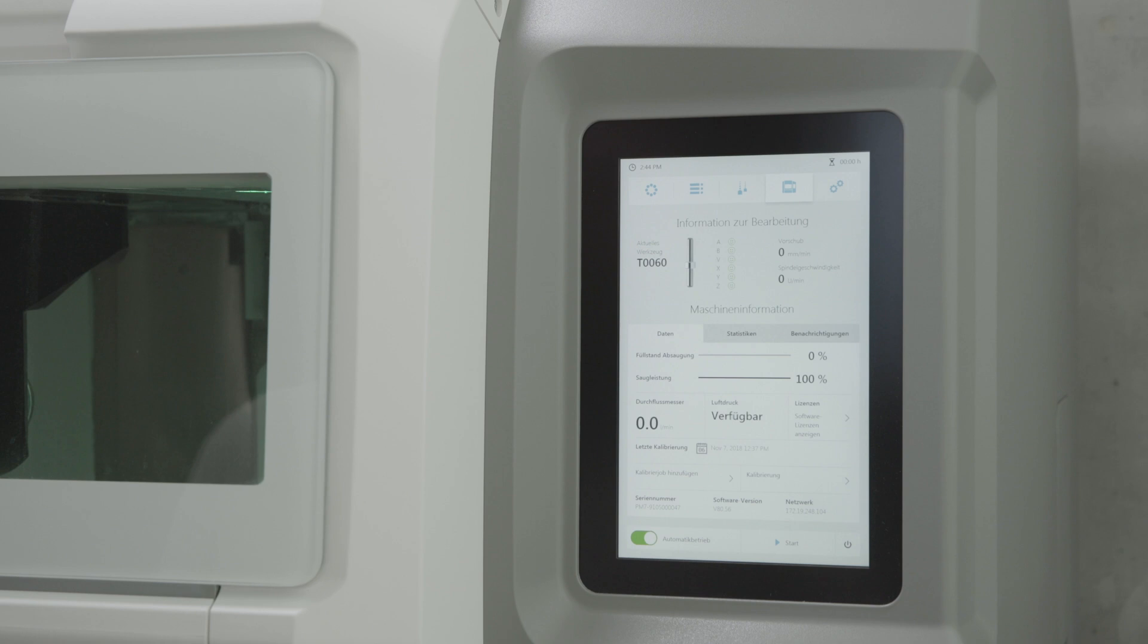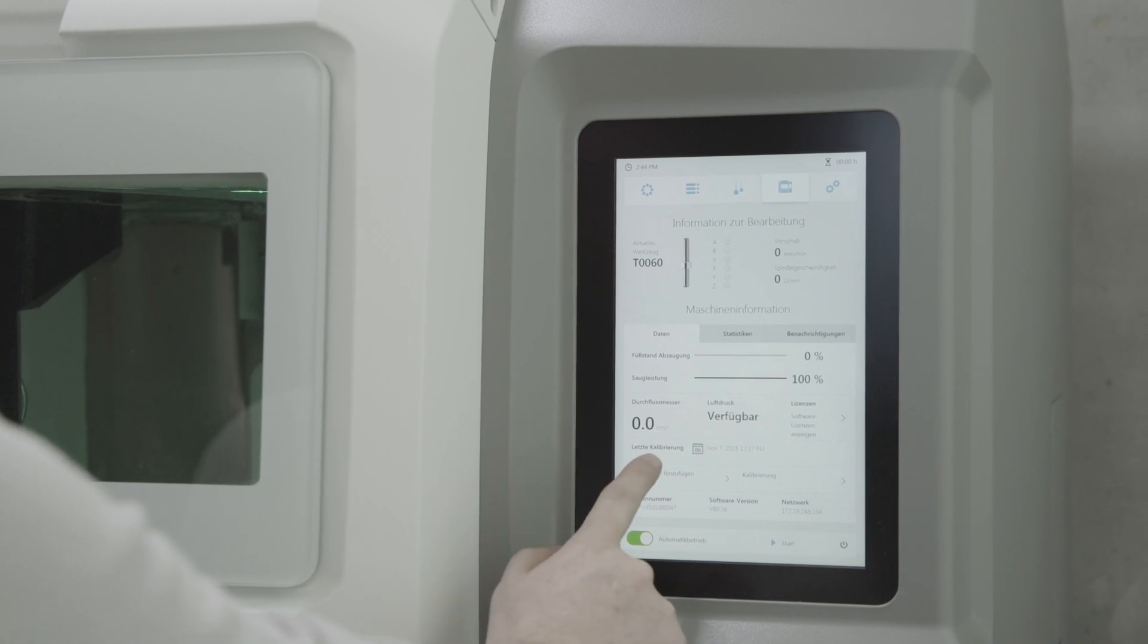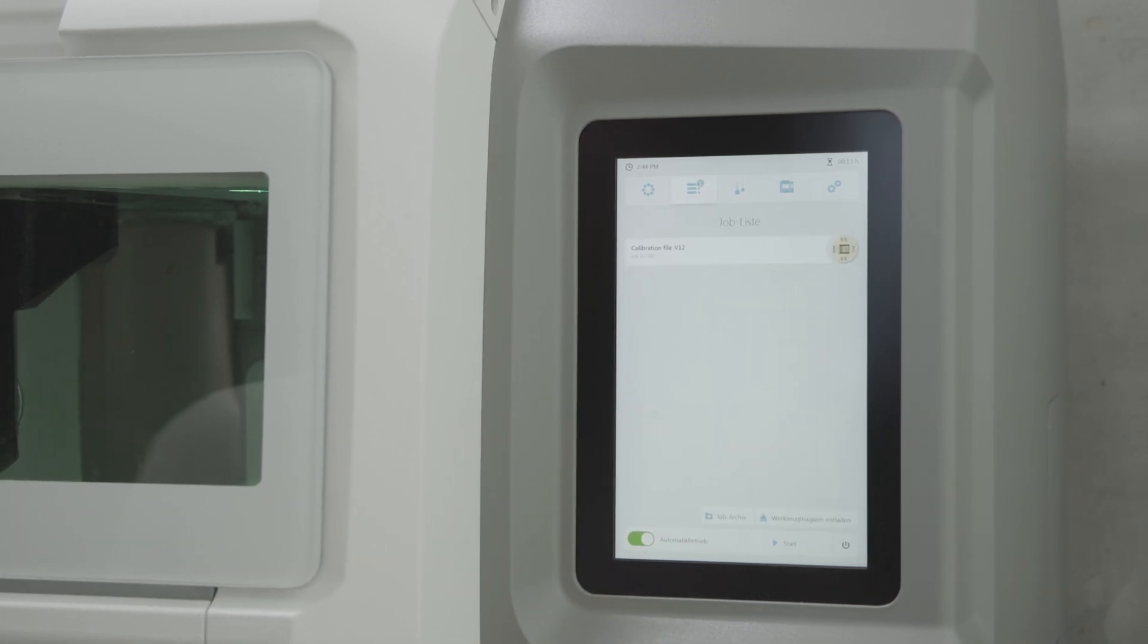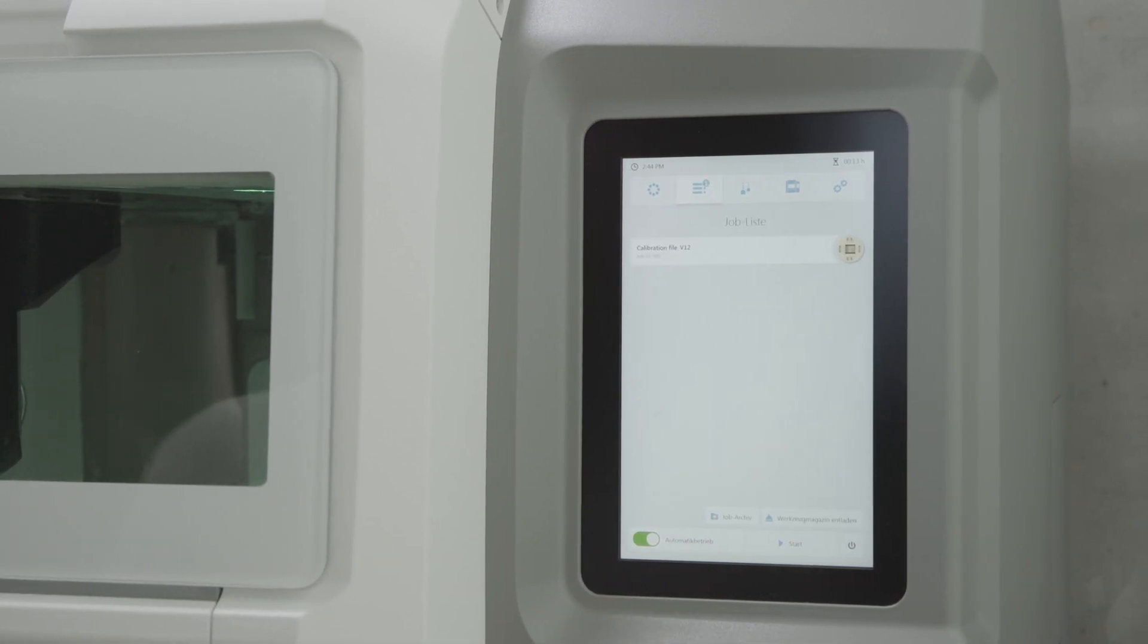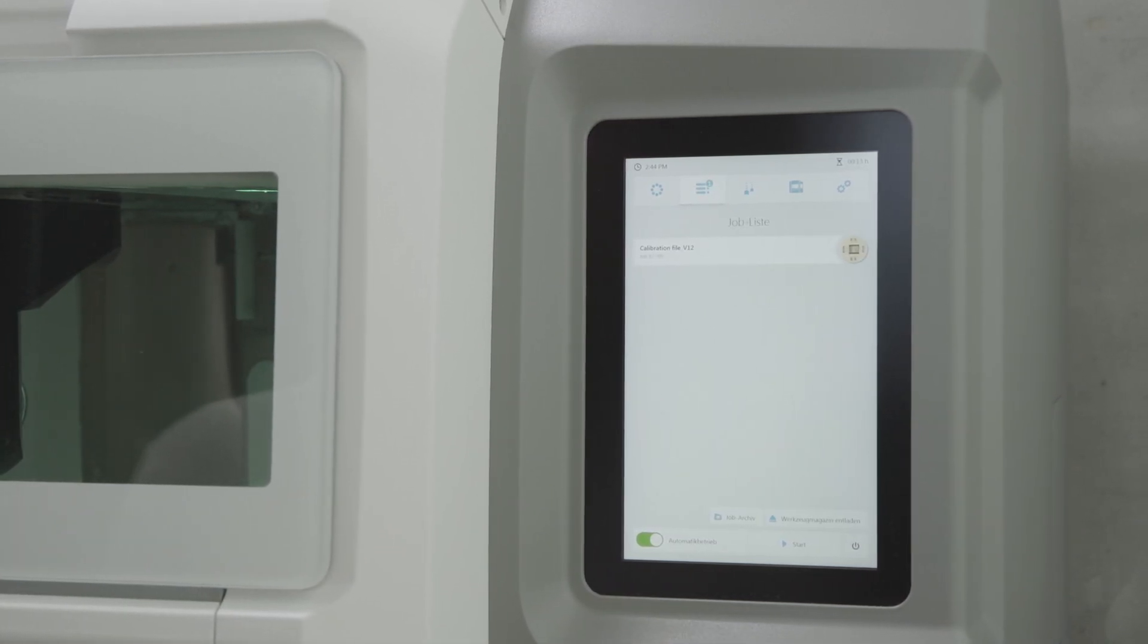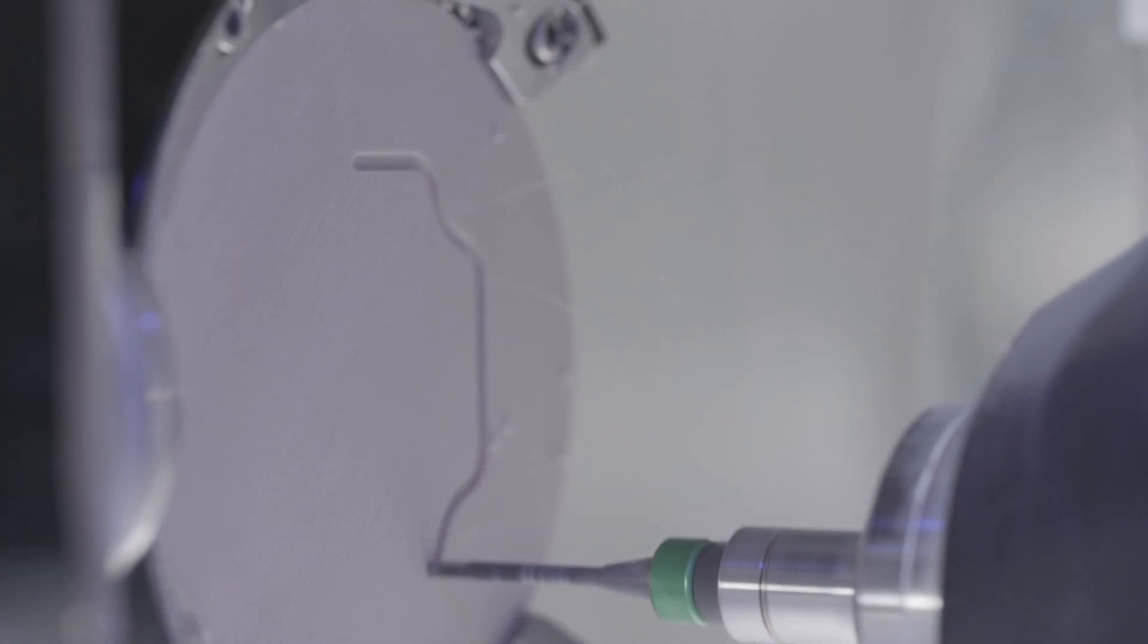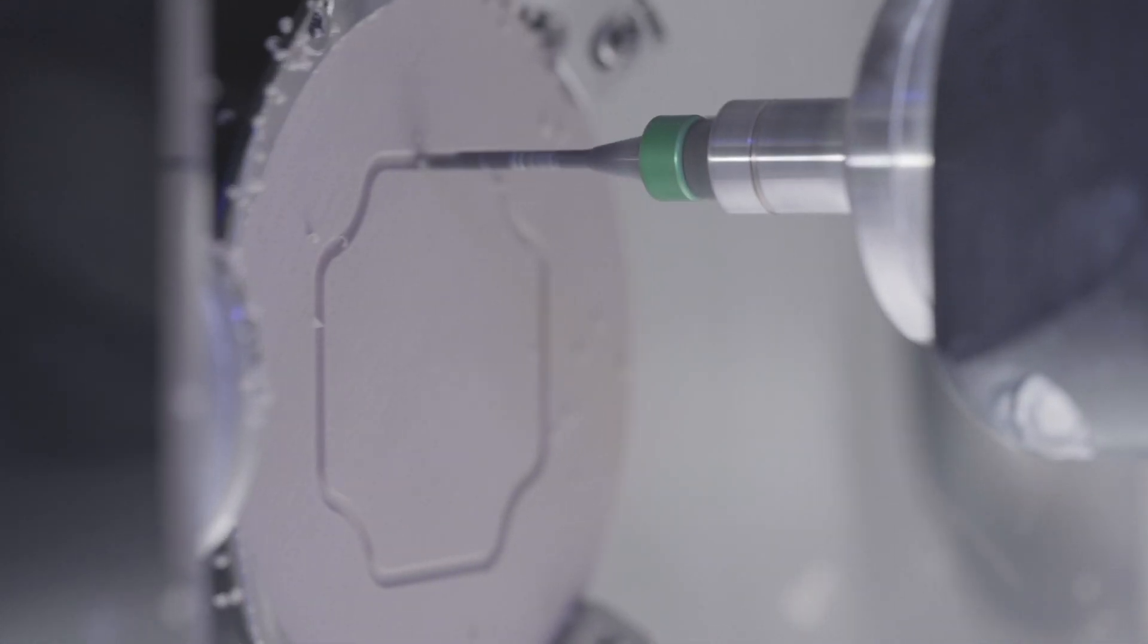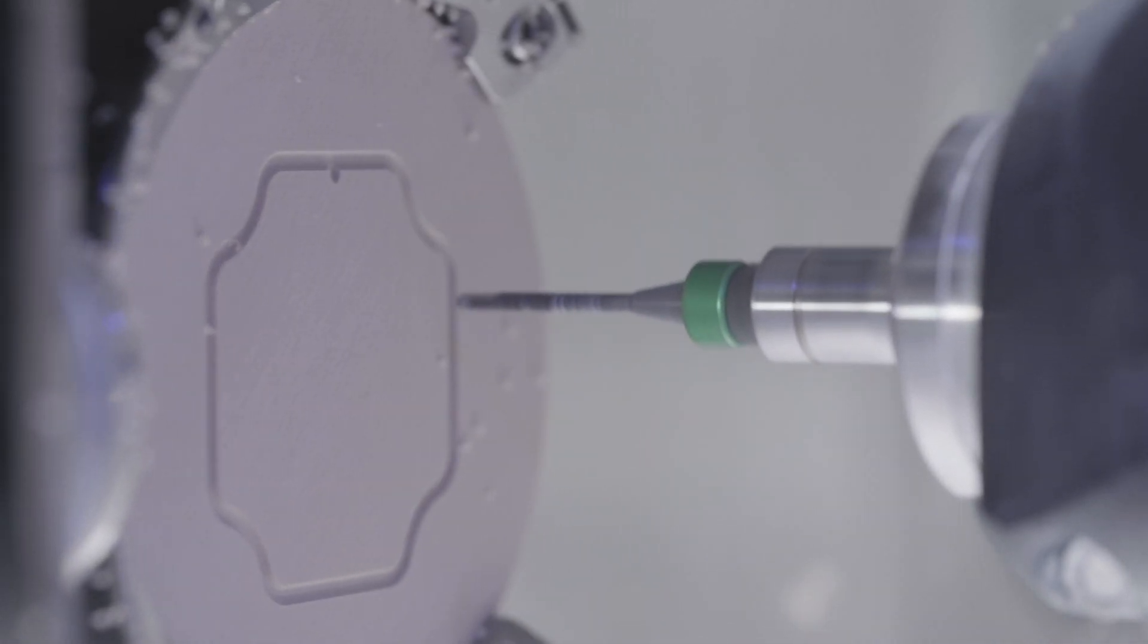Tap on Add Calibration Job under the tab Machine Information in the jobs list. Tap on Start to initiate the calibration job.